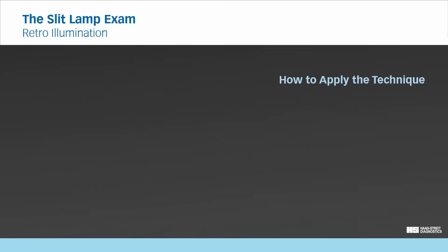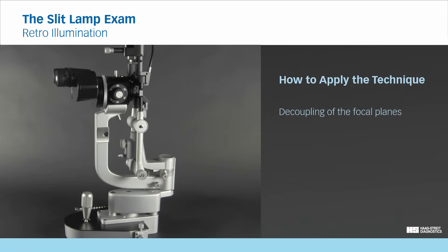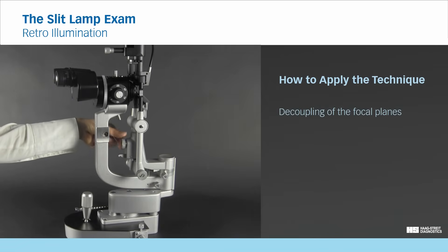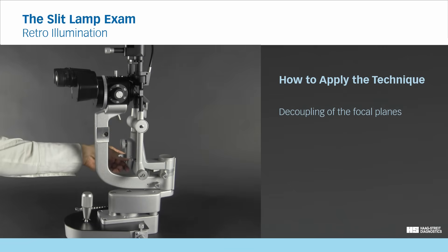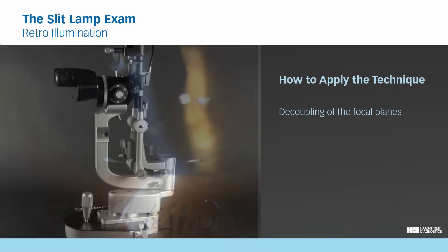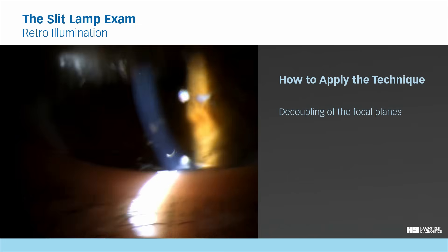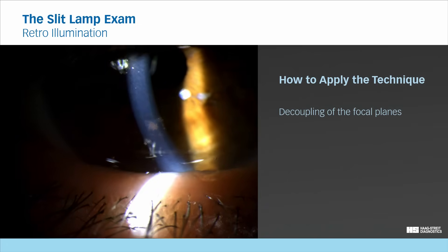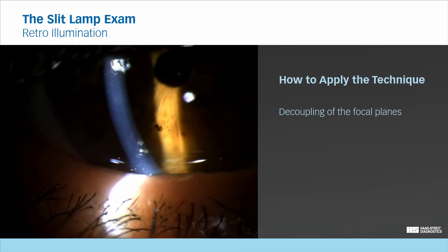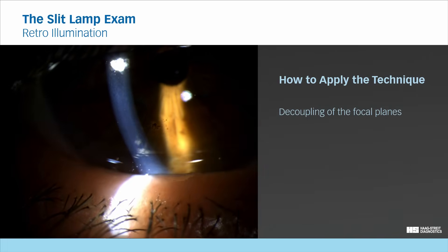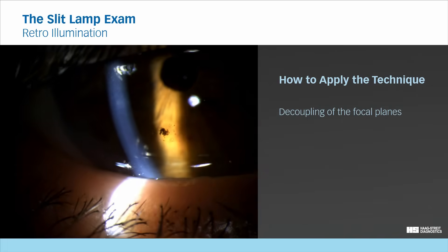Decoupling can be done by loosening the decoupling knob and rotating the illumination tower. For observing with decoupled illumination, start by focusing on the area of interest. Once you are in focus, decouple the slit illumination beam and gradually change the direction until it illuminates the structure behind your area of interest.